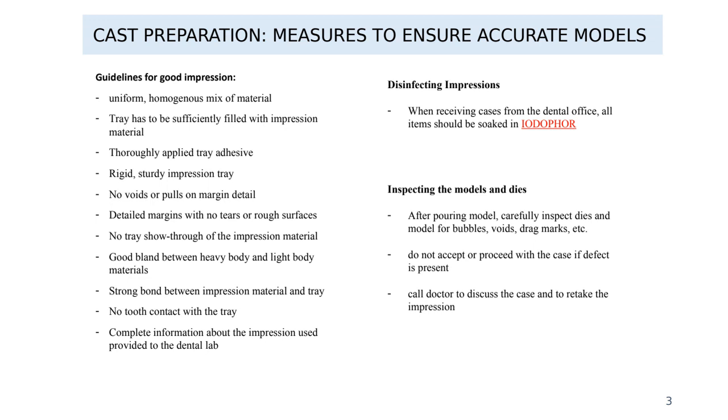Also, if we're using any other type of impression material, all of them have an expiration date. So let's say a dentist takes a final impression and sends it to us, but we get busy, we're working on different cases, and we forget for 2 weeks to pour that impression. That impression is not accurate anymore. So we have to talk to the dentist to take another impression, and they're not going to be happy about it. Okay.